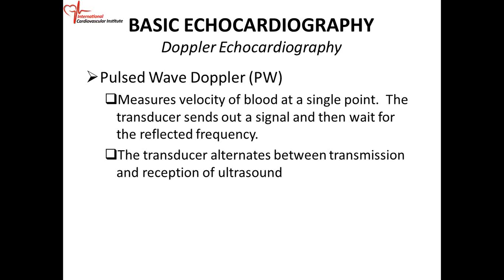And then we also have tissue Doppler imaging. I didn't put that here, but we have that lecture separately. TDI, tissue Doppler imaging, is where we actually look at the movement of tissue. This is a form of pulse wave Doppler. It's just that the velocity is usually much lower than, say, the movement of blood. But tissue Doppler, TDI, is a form of pulse wave Doppler as well.